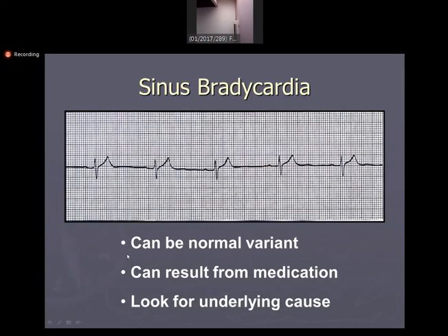Now, what is bradycardia? Up till now, I think you can identify the rate, the rhythm, and whether it is sinus or not. Now, here, what is bradycardia? Bradycardia is if the rate is less than 60, or what we call in cardiology less than 50.